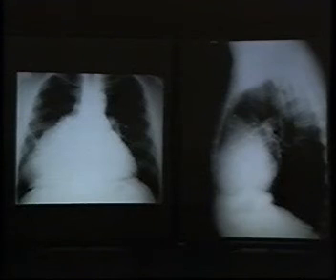And you can make these diagnoses, but if you have to study this by MR, you're going to spend an awful lot of time because the two hearts beat. The heart is denervated, so it beats at a different rhythm than this heart, and you can only get one heart at a time on an MR scan. Usually for the second heart, you can fool around, the EKG has to go somewhere posteriorly on the right side before you're going to pick up the second EKG and be able to get decent gated images.